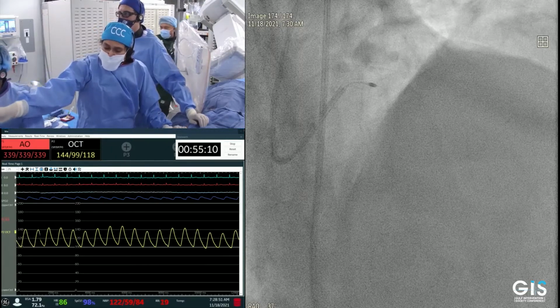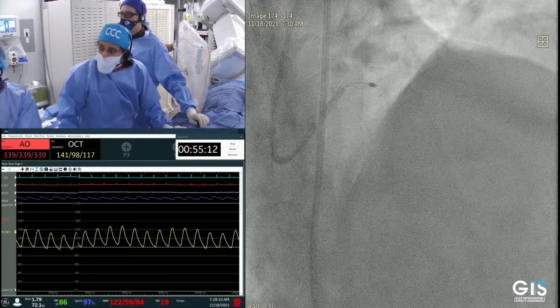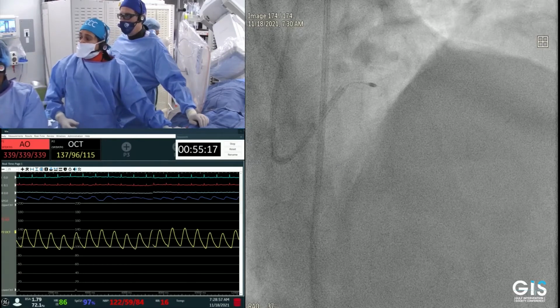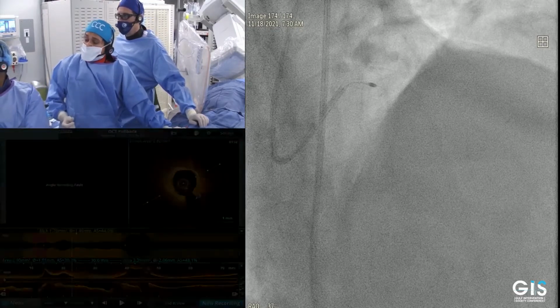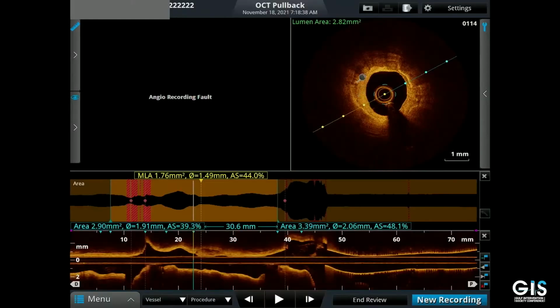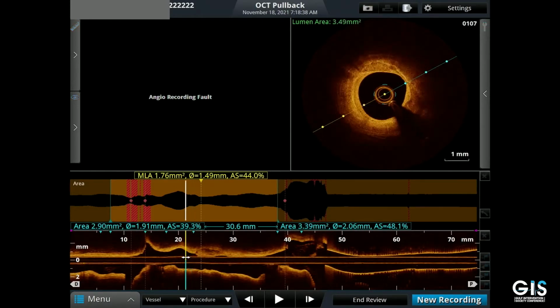Kiski, can you give us the calcium score? Okay, we are talking the arc is more than 180, right? And the depth is more than 0.5 millimeter. Actually, this part, the calcium arc is from the 10 o'clock to almost 6 o'clock. I think it's almost 3 quadrants. Good, more than 180 degrees. And the depth of the calcium?